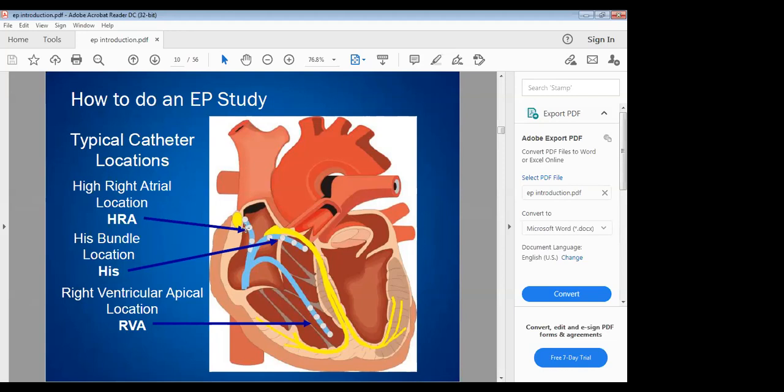Great question. Thank you so much. So number one is that you are the one that will determine the time. And that will differentiate the definition from sinus node recovery time. I will explain the sinus node recovery time. But for the SCL, sinus cycle length, you are the one that will determine that duration. And the pacing interval, you determine it. And even before the electrical activity gets to the terminal end, you can actually generate another atrial premature complex. Meaning that you didn't wait for the cycle length to finish before pacing again, all in the aim to generate a premature complex to initiate an arrhythmia.